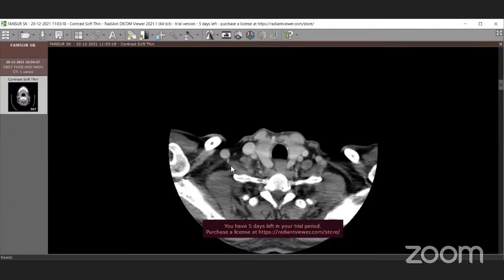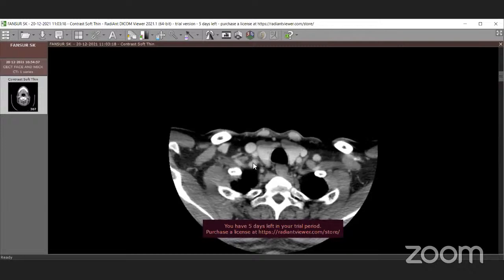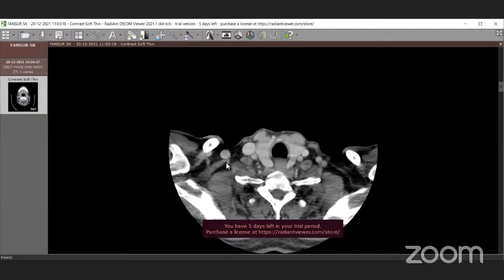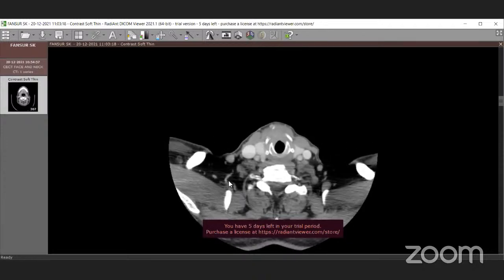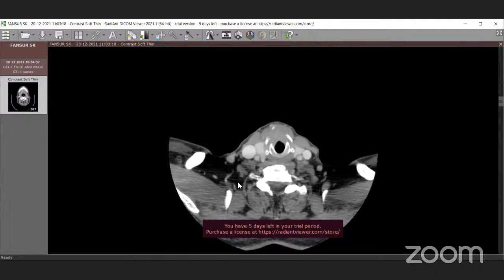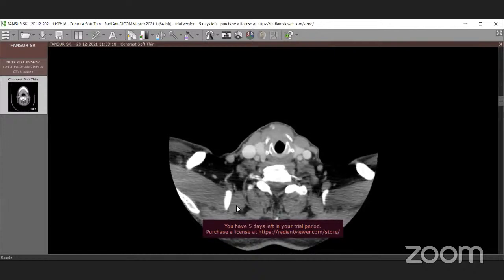So these vessels, starting from the subclavian artery and just going and lying in the fat plane at the root of the neck. This is the level of the transverse cervical vessels. This is the first appearance. All our residents want to see this structure. So this is the appearance of the transverse cervical vessels from the thyrocervical trunk.